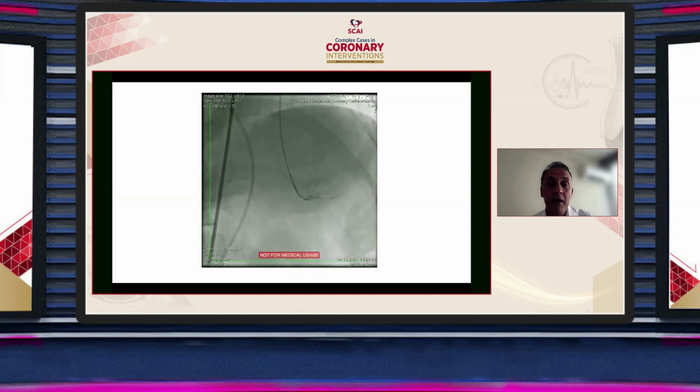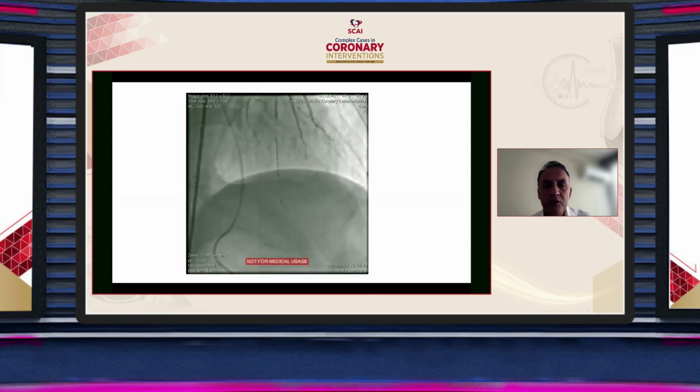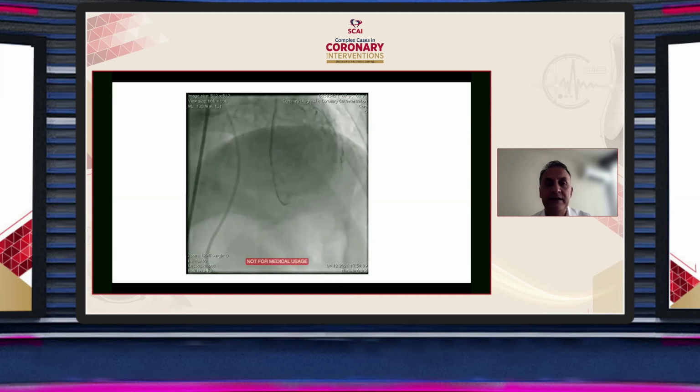There is a pericardial effusion, and at the moment it was the live case from one of our meetings. And after that, we see the bleeding. What we did here, we embolized with a cut balloon. Two cut balloons seal and occlude the vessel, and solve the problem.